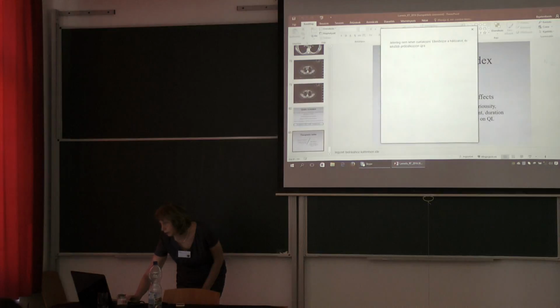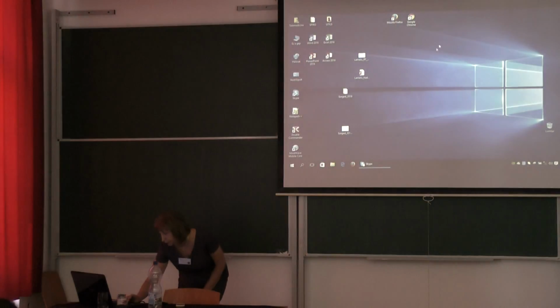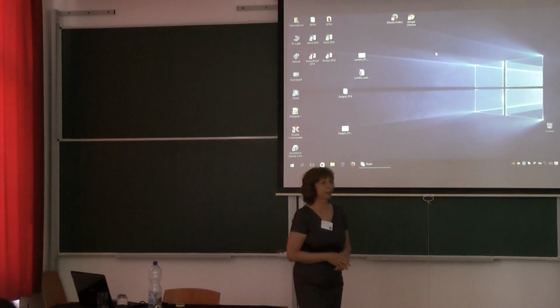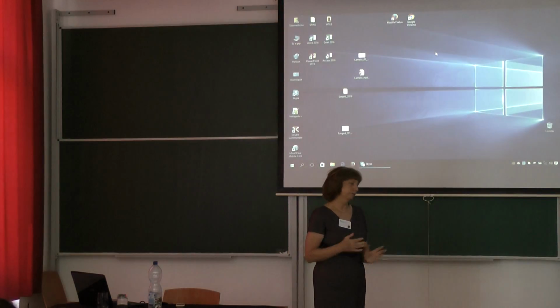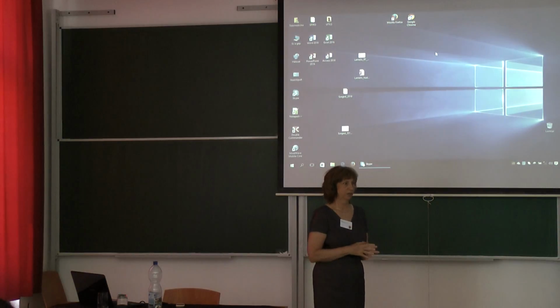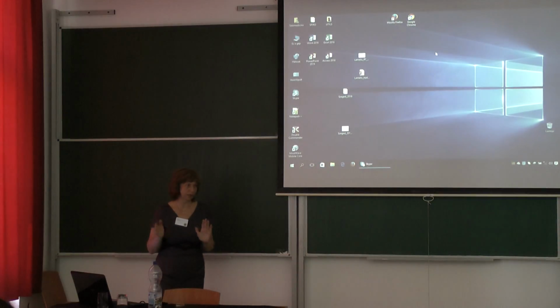There are several approaches to use PET-CT, and I myself like better than this static SUV concept, which is always 2.5 or in this region, in between 2.5 times the normal uptake, or higher, or sometimes 3 times.